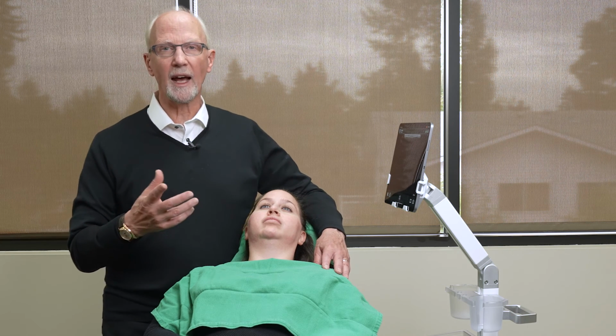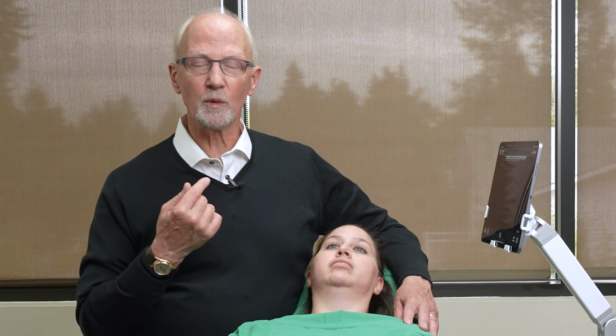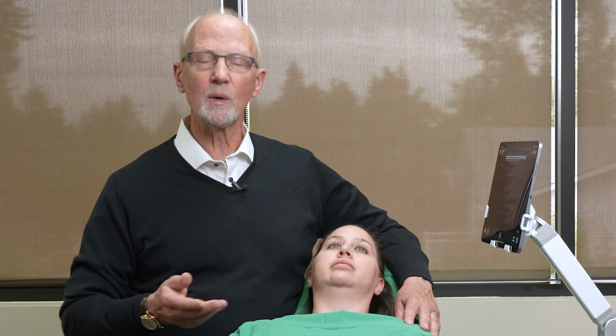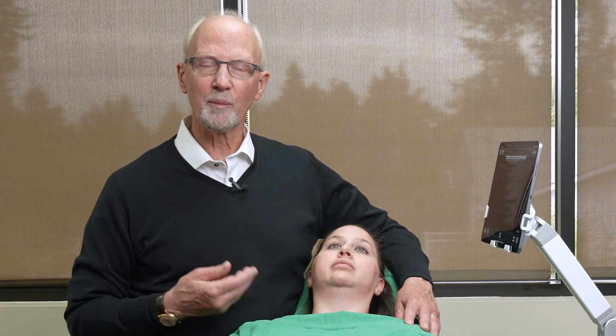In addition, we've looked at a number of anatomical structures so that we have a good idea of where the parotid is, how it extends all the way from the angle of the jaw up to the zygomatic arch. We've looked at when we've placed product within the deep piriform fossa to examine for the vessels being patent after our treatment. So we've seen a lot of use of ultrasound, not just treating complications, but active treatment, and the results of treatment, which then you can translate into how you can dictate changes in your therapy, your technique, and your approach to your patients to get the results you're looking for and to help them look their best.